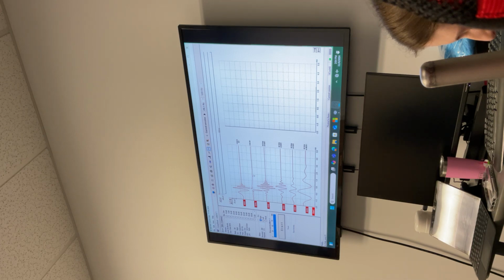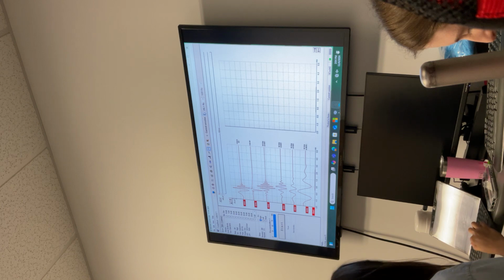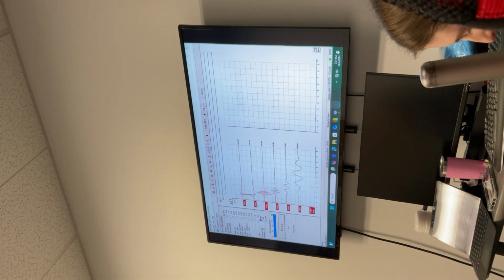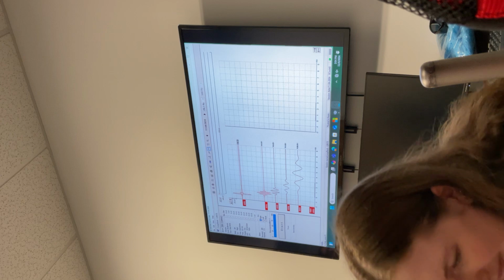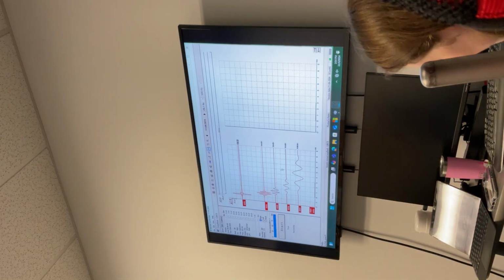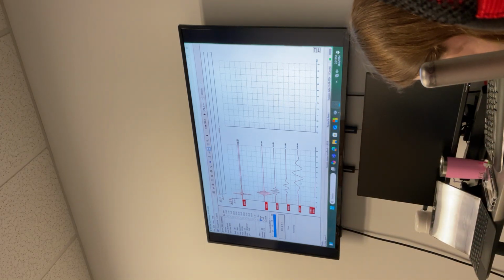Is click and tone burst onset different? It all starts at the same time, 0. For tone burst, 0 is the onset of the sound. You can go to this tone burst here. You can see, this is all starting here. This is 4,000 hertz 5 cycle, 2,000 hertz 5 cycle, 1,000 hertz 5 cycle. This is 500 hertz 5 cycles.